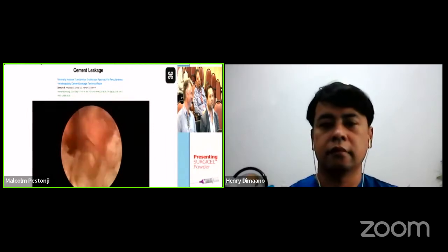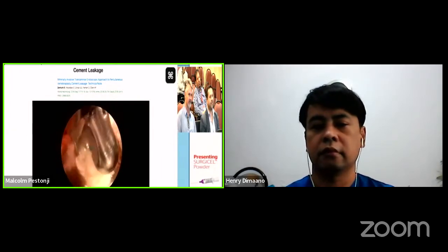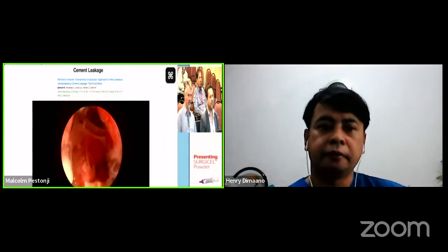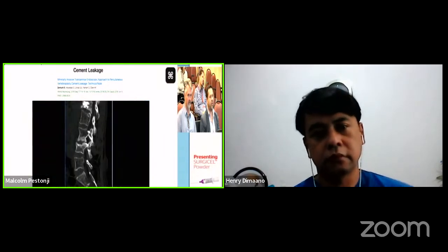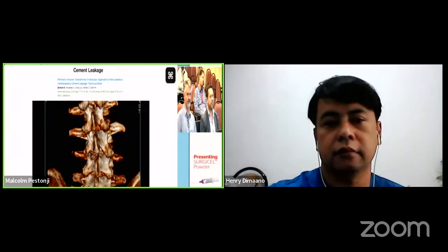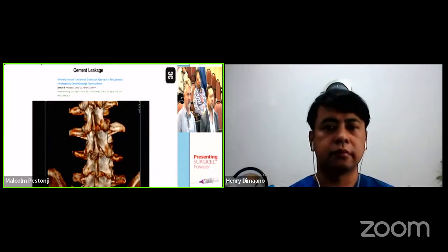You can see an endoscopic view. Under endoscopic view, I removed all the cement. Here is the cement part, and we look into the spinal canal. We may check around, whether there is any compression or pathology. You can check all around, and you can see there is a little part of laminectomy. And we discharge these patients the same day.